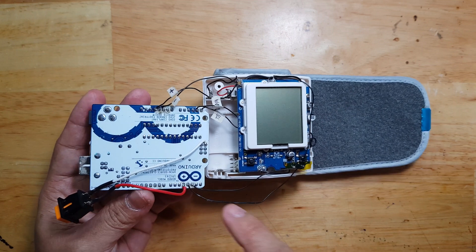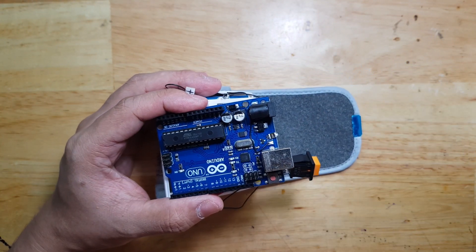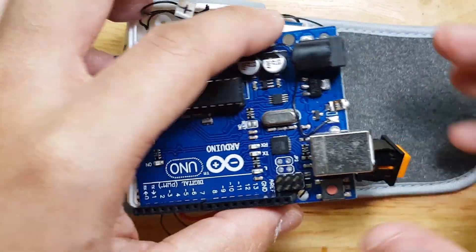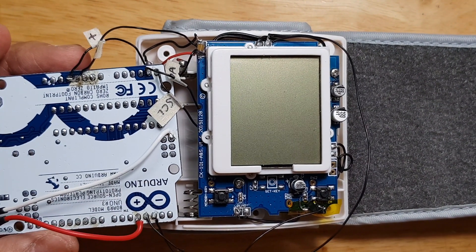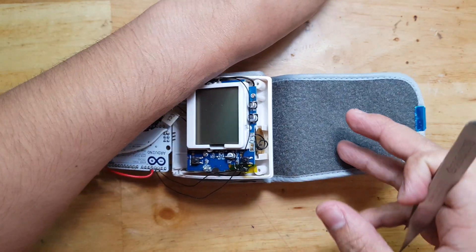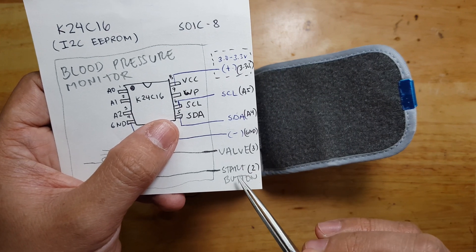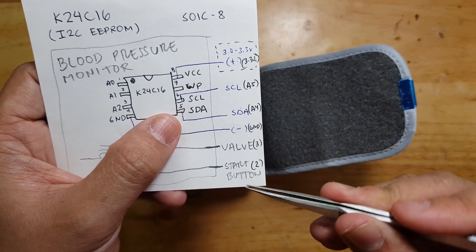I'm done hooking the wires to the Arduino. This is a modified Arduino from 5V to 3.3V, already with a 3.3V regulator so I don't need to use a logic level shifter. The valve is connected to digital pin 3, the start button is connected to digital pin 2. This can be changed in the code so it's not critical.